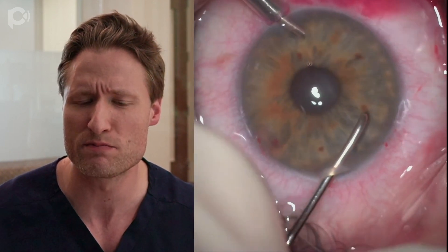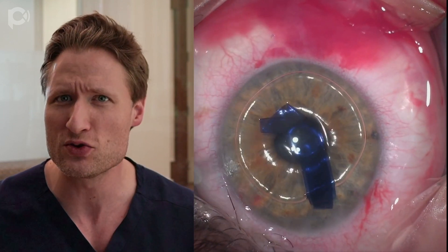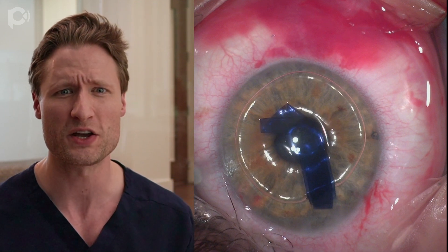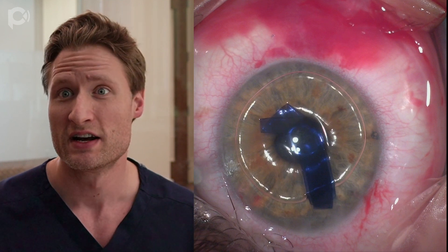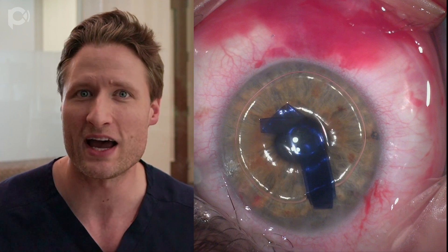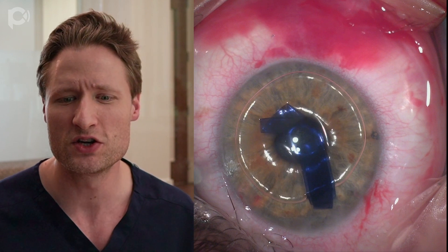Now I'm refitting the AC maintainer to balanced salt solution and making my iridotomy. This is with a capsulotomy handpiece that comes with our phacoemulsification machine made by the Swiss company Oertli. I like using this device to make peripheral iridotomies because you don't have to go underneath the iris with a needle scratch-down technique, so you don't risk damaging the lens capsule. You don't have to grab the iris and pull it out through a paracentesis and cut with scissors — that's bloody and imprecise. This capsulotomy handpiece simply cauterizes a small hole via a diathermy technique in the far peripheral iris, giving you minimal tissue destruction and no bleeding — and you can do it simply even in a phacic eye.